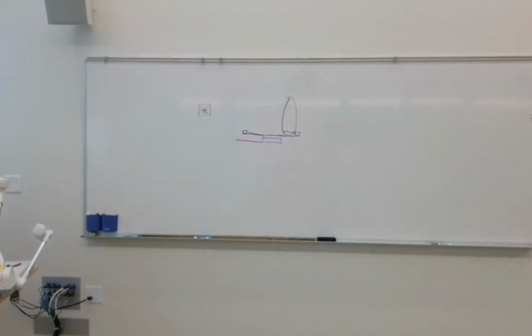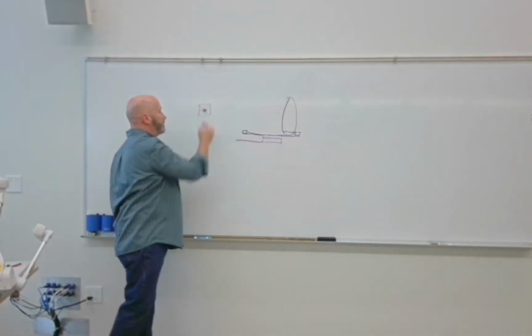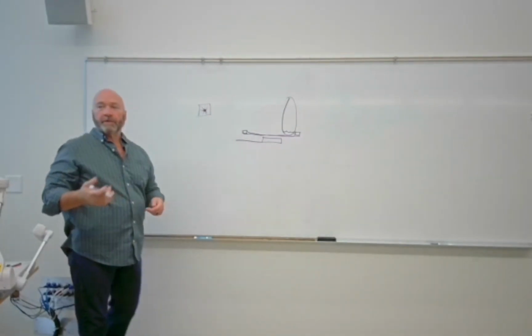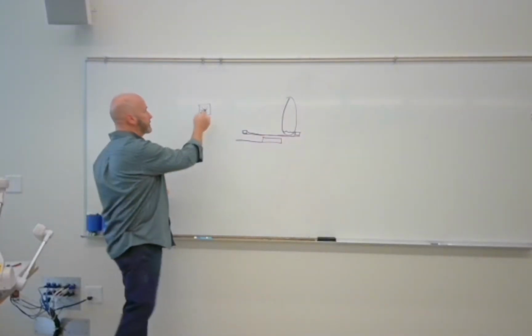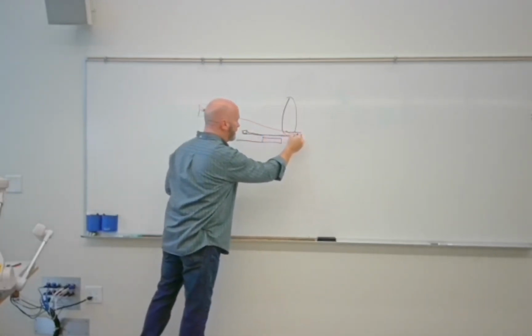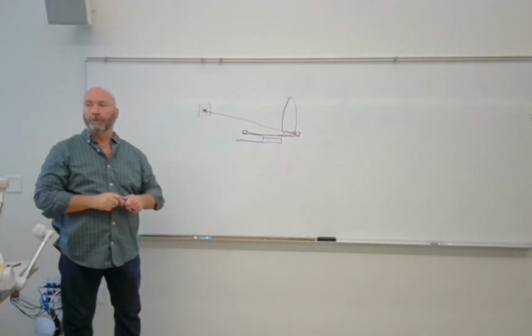So what that means is we create an X-ray beam at a pinpoint source, right? It's very small. It's measured in millimeters. Where all of the X-rays that we're going to use come off is measured in millimeters, which means that the X-rays are going to come off and they're going to spread out. And where is my air fluid level going to show itself to be?